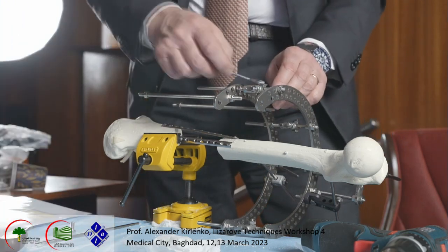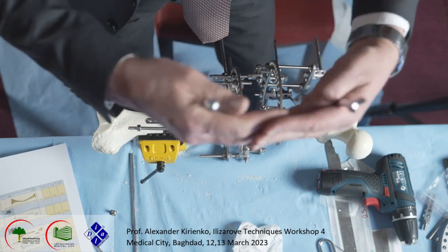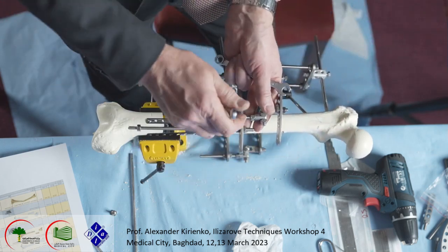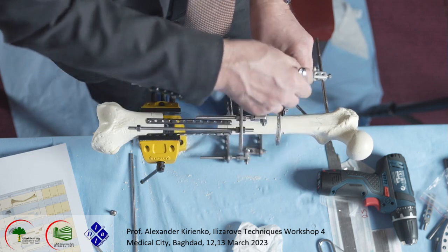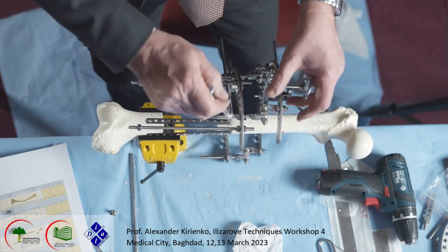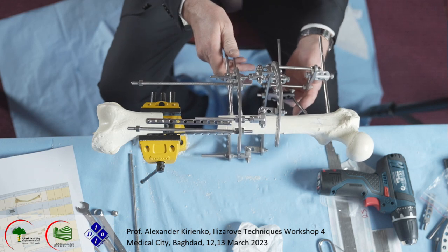If you do correction of varus, they should work in the same plane, because if they incline, they will be blocked and no correction is achieved. Okay, now much more comfortable for the patient. And we practically finished the proximal part.